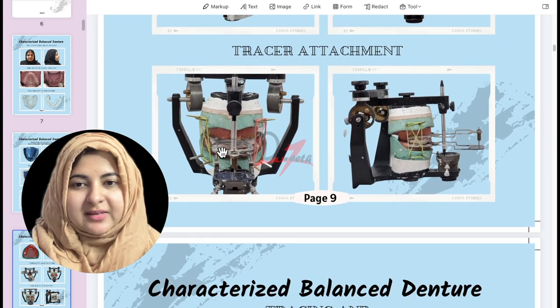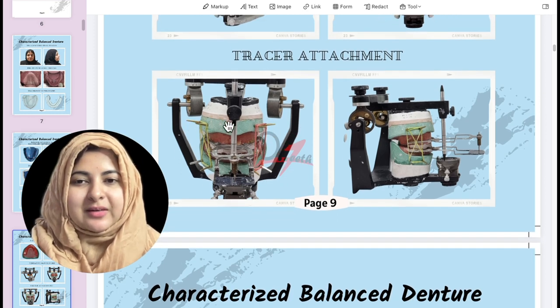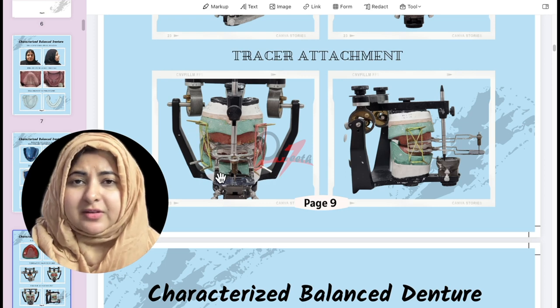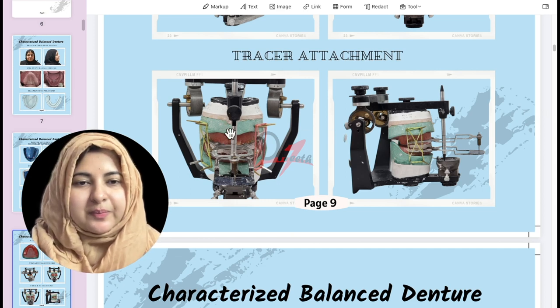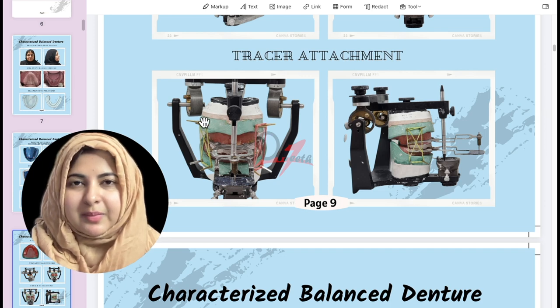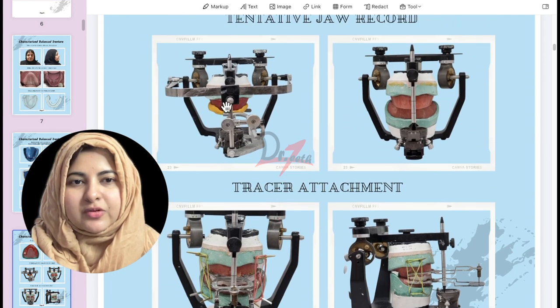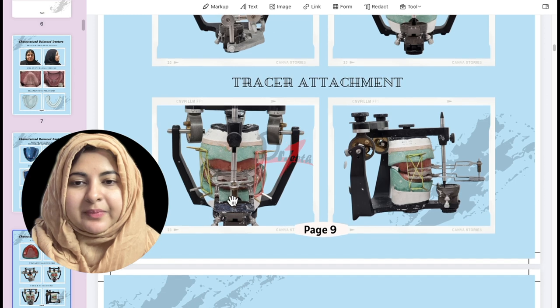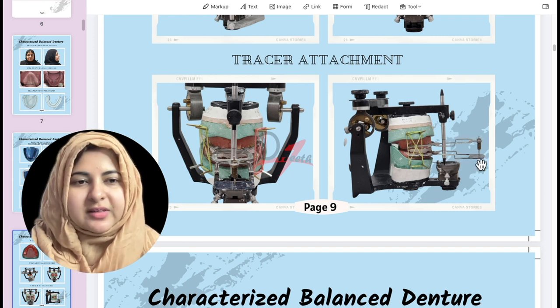Next, tracer attachment — a topic I'd like to cover separately — but basically we have four die pins used to hold the assembly together when using a split cast method. For the split cast, we make notches on the master cast, use boxing wax, then pour another layer in die stone. After the facebow transfer and mounting the upper cast, the tracer is attached parallel to the Ala-Tragus line. The arrangement can go upward or downward — what matters is there are no interferences.